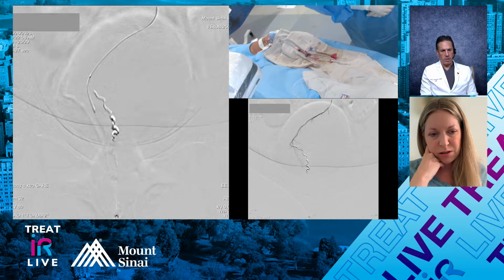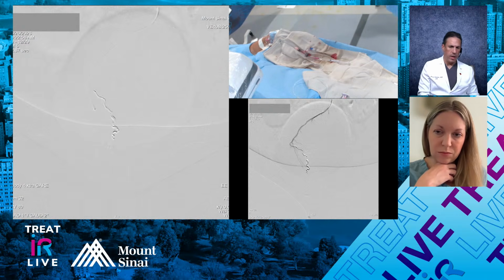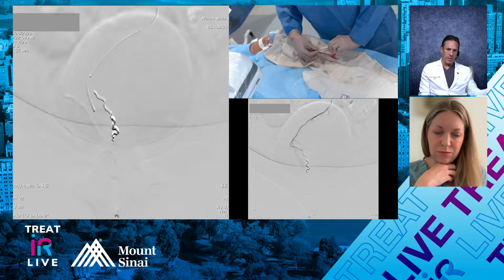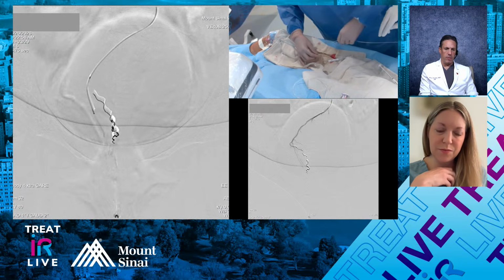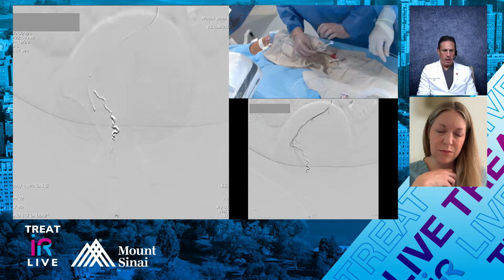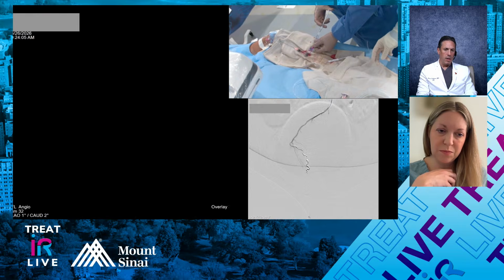The reason I ask is because with this procedure, we've essentially taken a concept, hemorrhoid artery embolization, which we know works, but we've taken equipment that's pre-existing, coils and particles, and sort of modified the way we use them for this procedure. But if we were going to say, okay, we need a different embolic for this, what I'm getting at is maybe a liquid would be better.